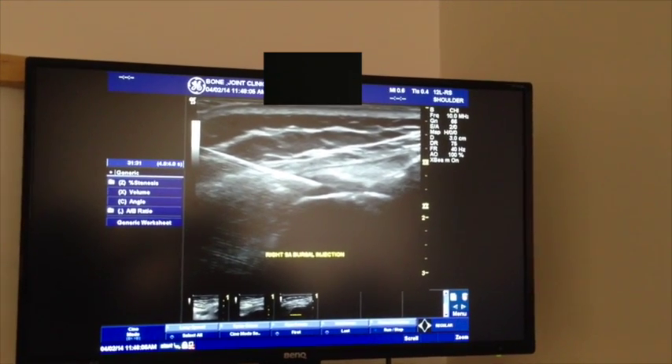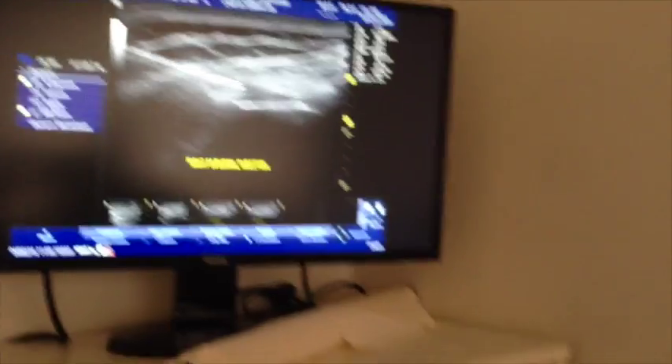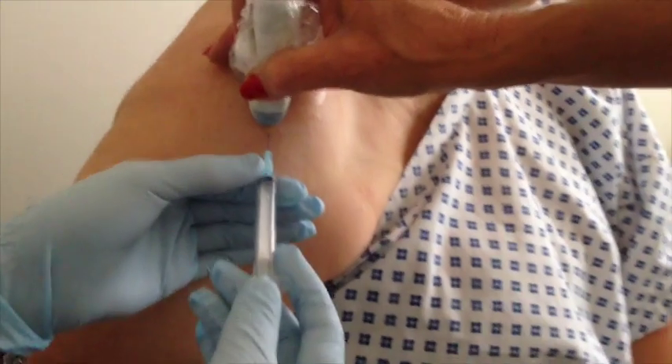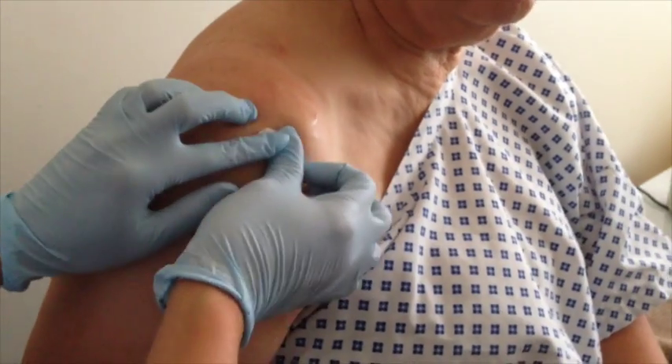And now the needle's about to come out of you. And we're finished on that side. The needle will now just come out of you. And we're finished. And I'll just press onto that. And that's all been done.